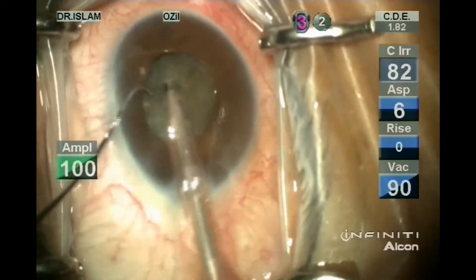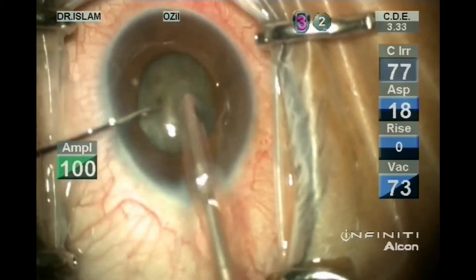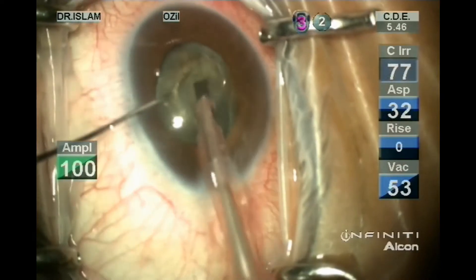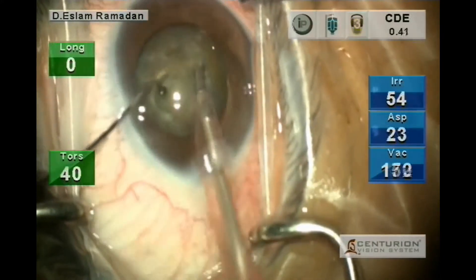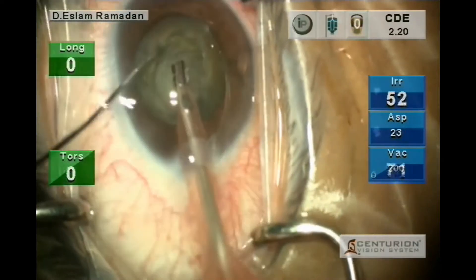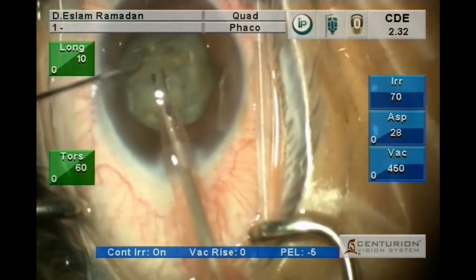We are using the Infinity now for the sculpting: torsional 100, zero longitudinal power. Then using the Centurion machine, we lower our setting to 60% torsional only. The vacuum increased from 100 in Infinity to 200 in Centurion. Still seeing a stable anterior chamber.